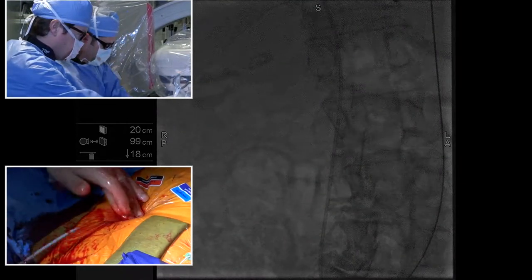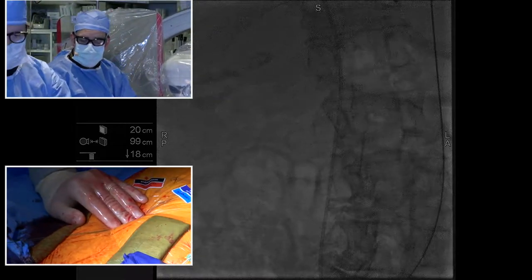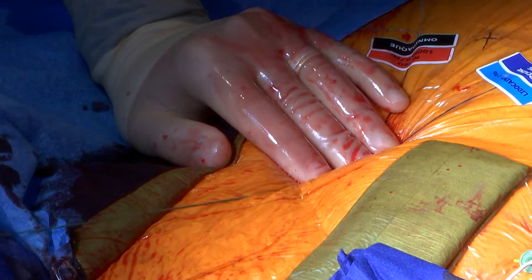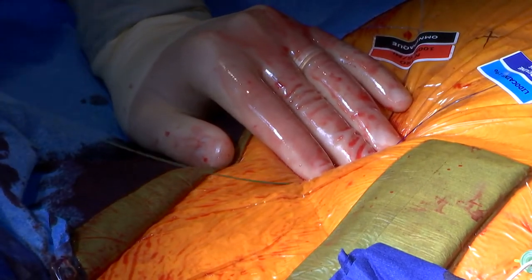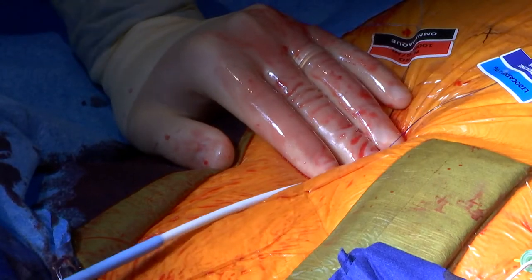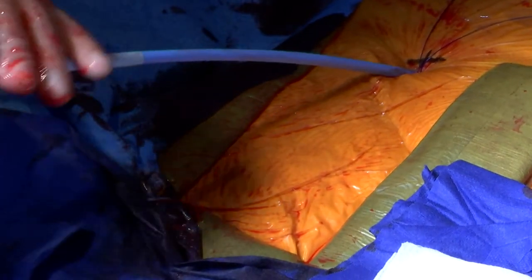And then we'll take the E-sheath. Now, for those of you in the audience that are engineers, you know that the E-sheath is fortunately going to go away. And we're going to have the ultra delivery system. I'm very excited about this because I've got to be honest, I'm not a fan of the E-sheath. My understanding is that the person who designed it is now working for Medtronic, but it's a less than ideal design. So we're going to have the Edwards up. And then we're going to insert this nice and slowly. We're going to watch it go up under X-ray and make sure that we don't have any problems.